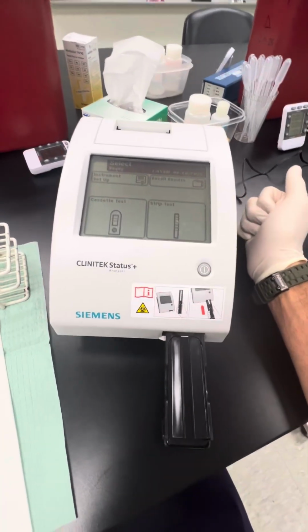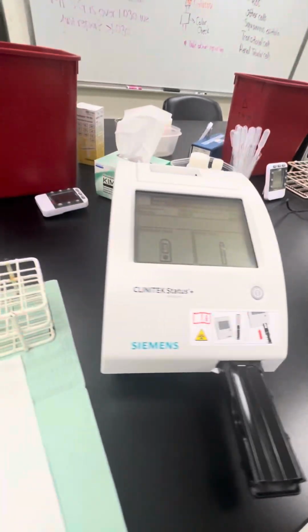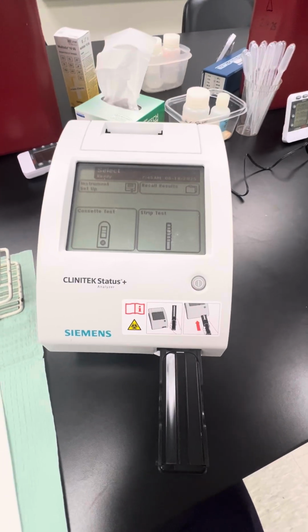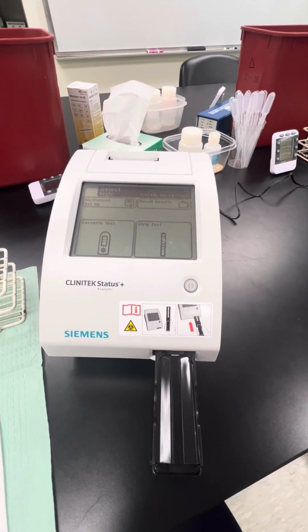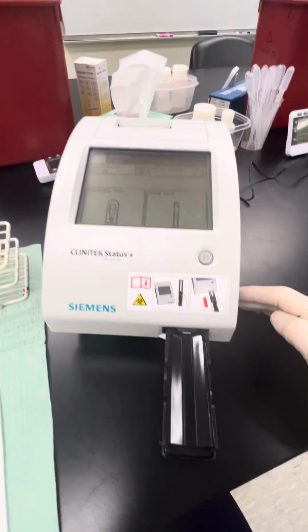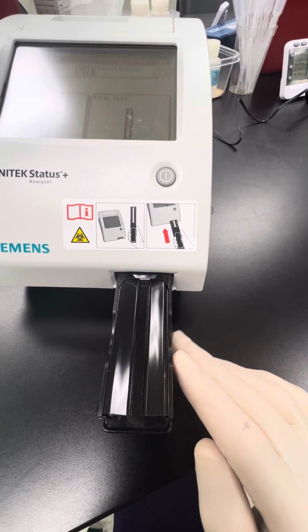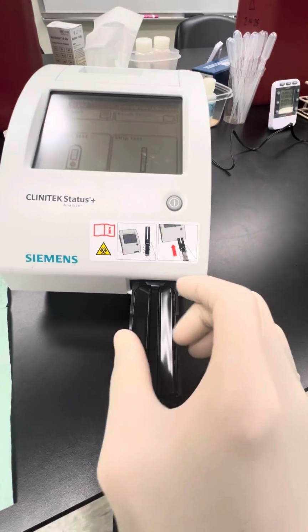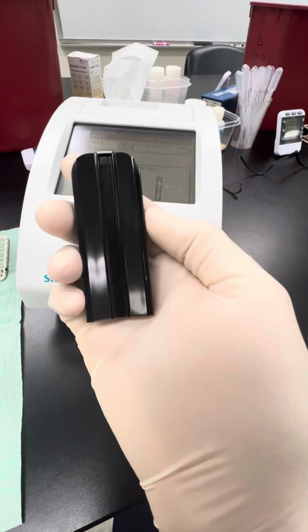Now, just to cover some parts of it, you'll see that it's an all-in-one instrument all by itself. It has a built-in screen where you'll do all the test ordering as well as look at the results. The way this machine works is once you've applied the urine specimen to the dipstick, it has this little tray that comes in and out of the instrument that you will align the strip onto when you're ready to use it.